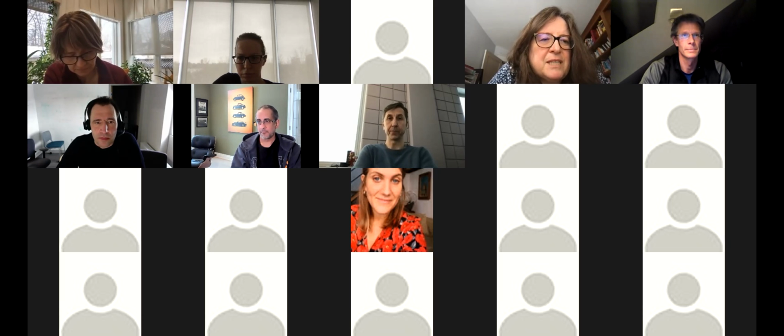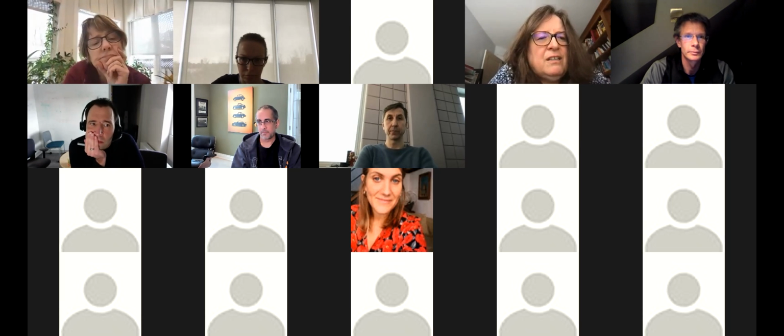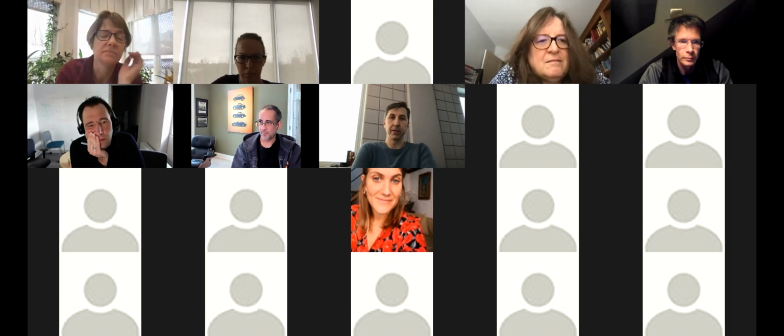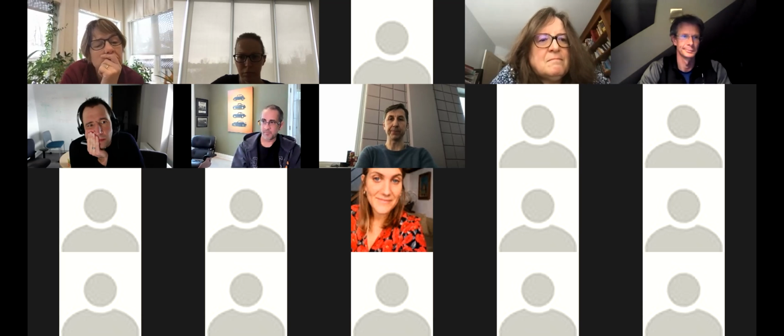Maybe we can book some scan time soon and just play with some things. Are there multiple sequences we should try, or should we just go with one? I'd stick to the multi-band. If you're going to go for just a bread and butter single echo, or non-slice accelerated type of sequence, it's just going to be too much trade-off, right? Your TR is going to get too long.